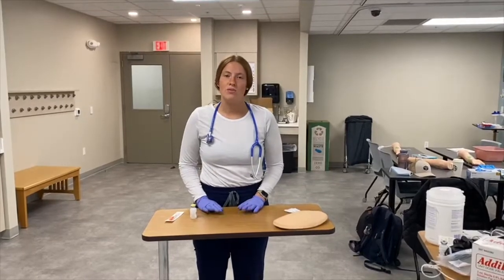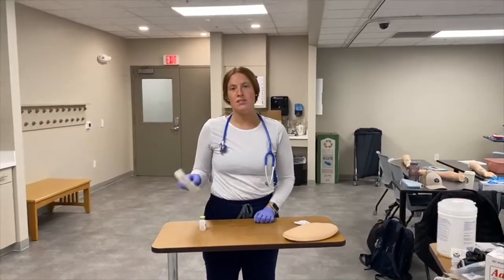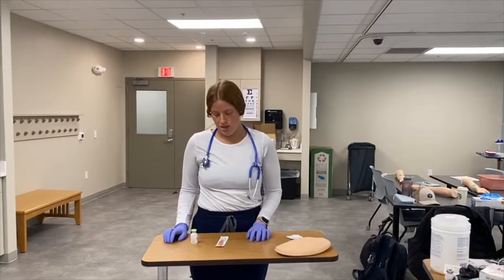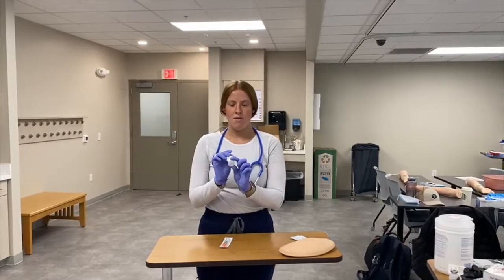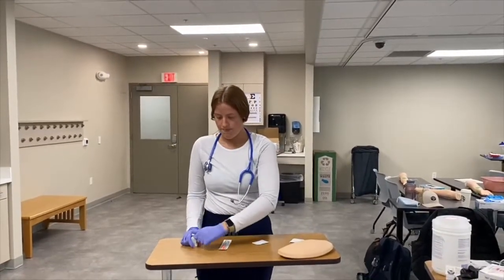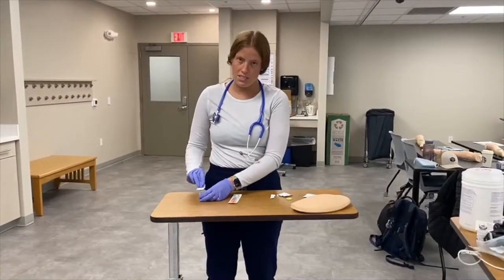Here's the process of drawing up and then administering a subcutaneous injection. I'm going to demonstrate with insulin — it has a specific needle and is measured in units. We're going to pretend the order is for four units of rapid-acting Novolog. Even though the vial isn't open yet, I still need to clean the top of the vial, for at least 10 seconds.